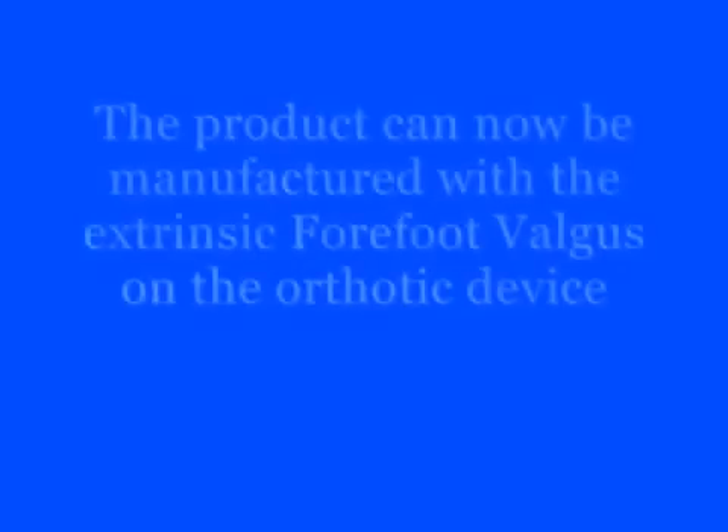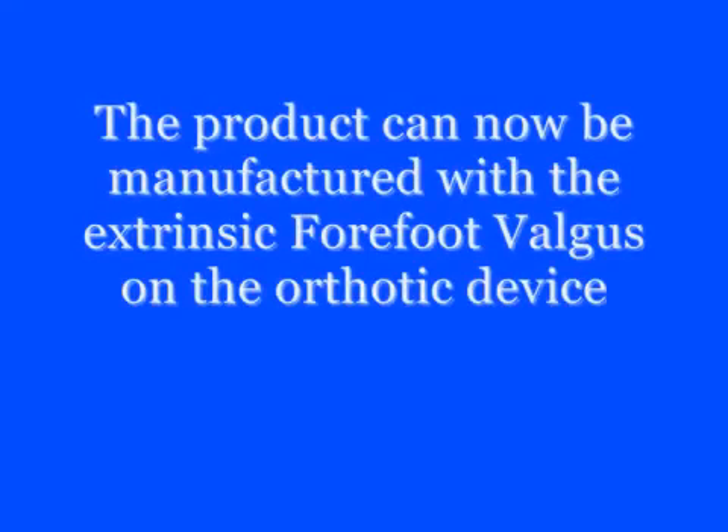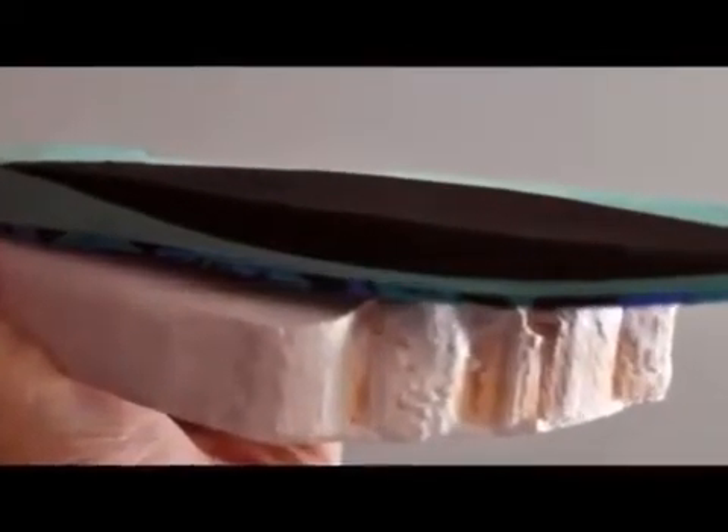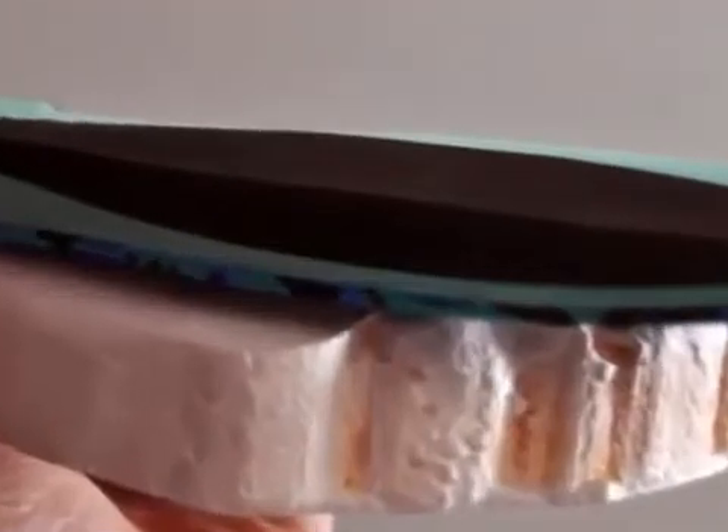A major benefit of this casting method is that the practitioner has full control over the finished prescription. The lateral forefoot will appear thicker as it takes up the forefoot valgus in the device.